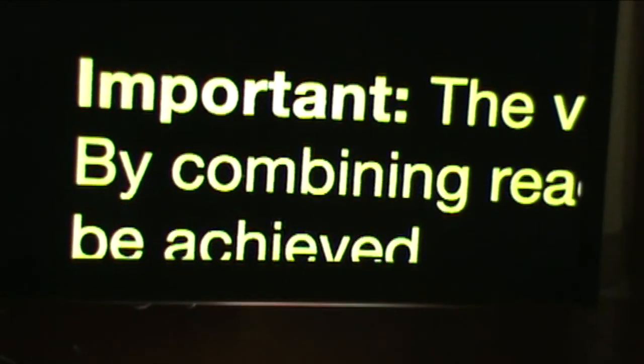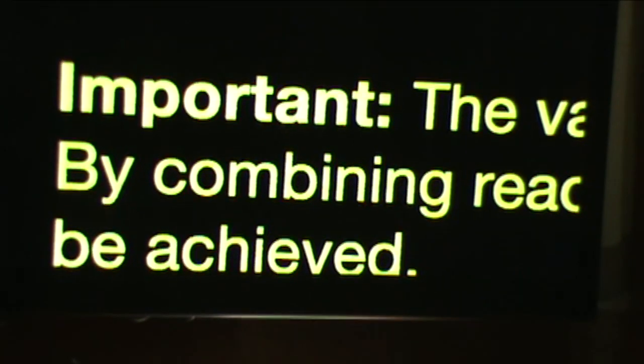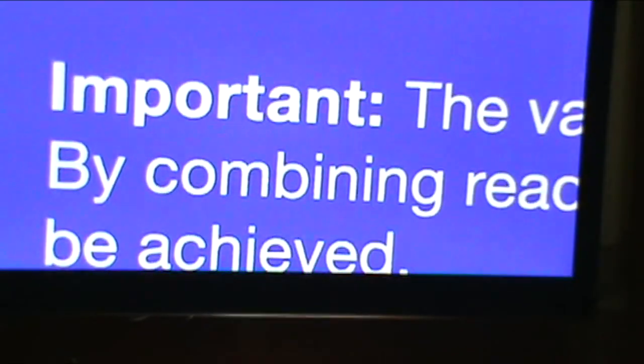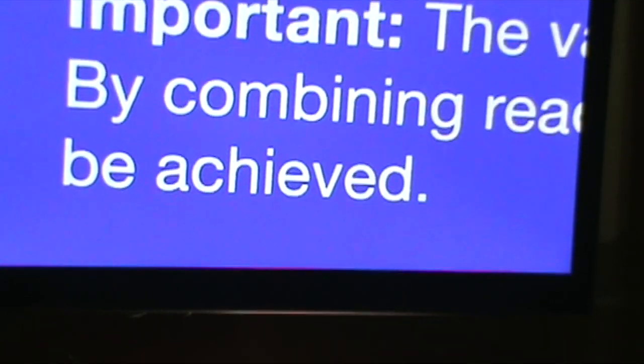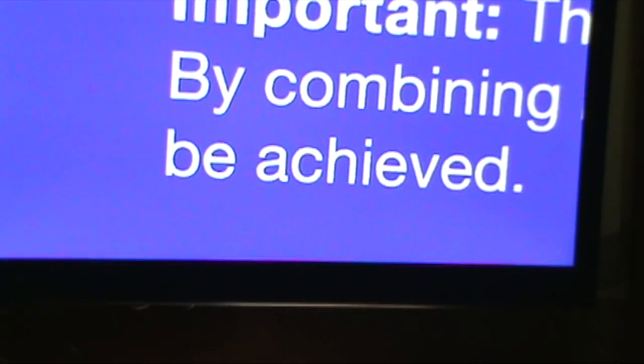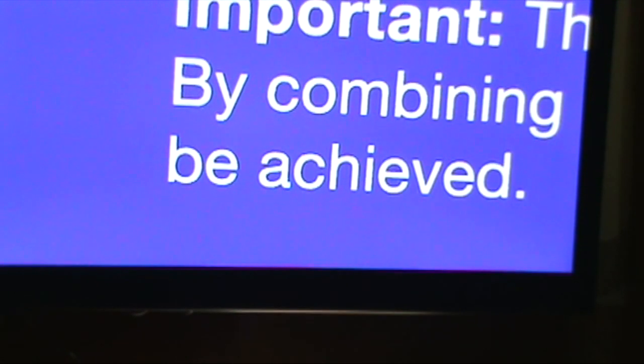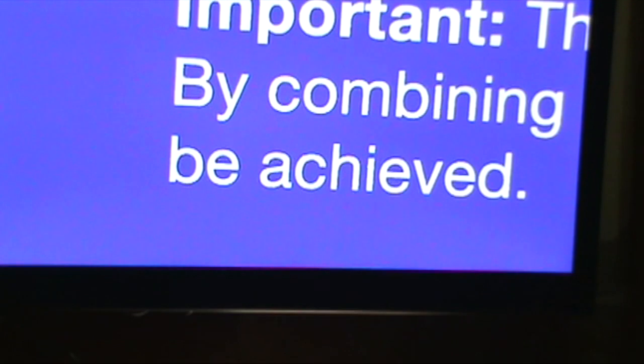We can also choose, let's say, another calming selection that people like, which is white text on a blue background. That's what we have next. And so if this one works well for you, you can choose this, but there are many different color choices. This machine does have this built in, so you can choose whatever color selection you want.